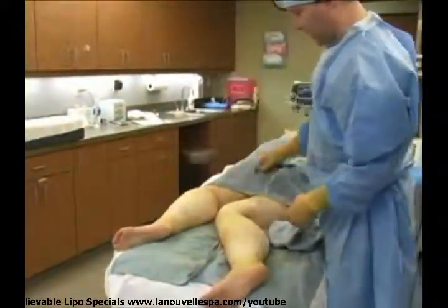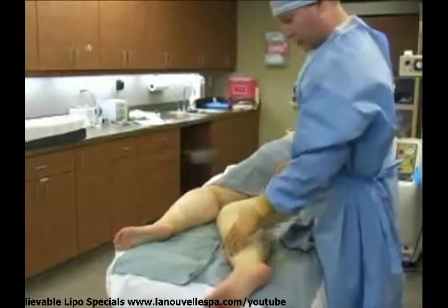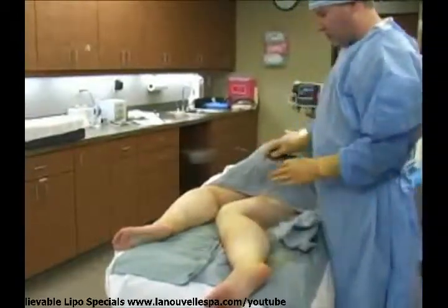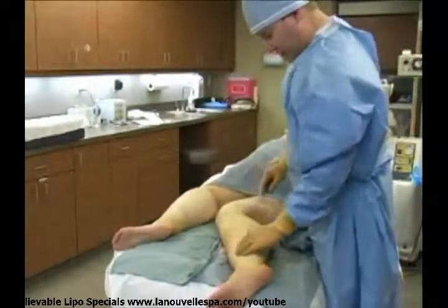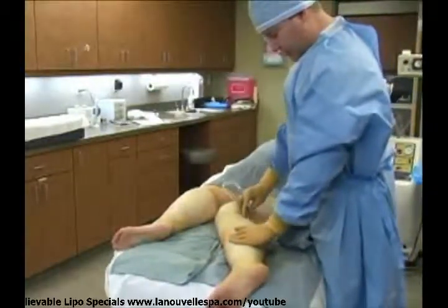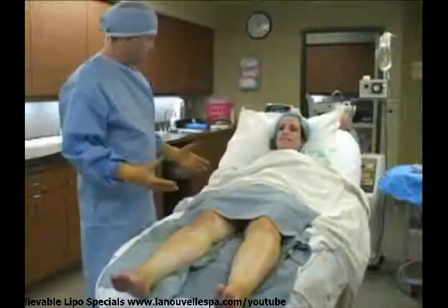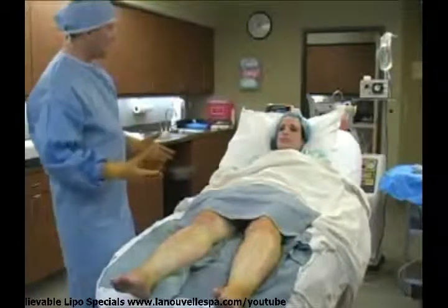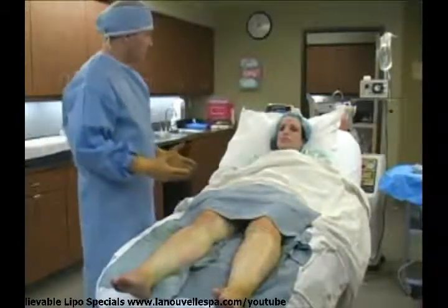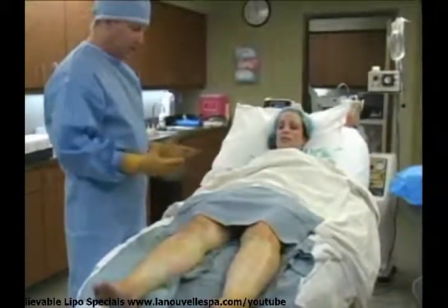With any sculpting procedure, whether you're working in clay or working in wood, you just piece away little bits here and there, and then you reevaluate and take a little more and keep shaving away. What we're going to do now is I'm going to probably stand you up and take a final look, but for the most part we got about a good 1.3 liters off. So great. You did great.